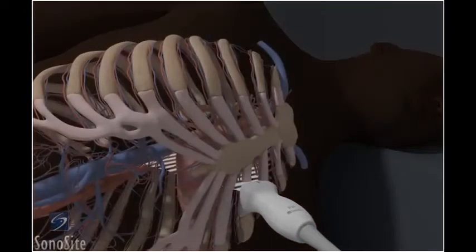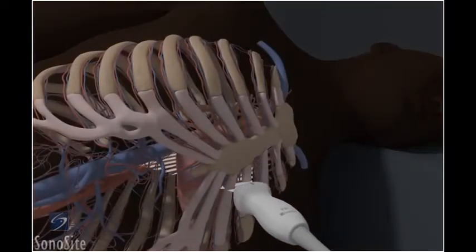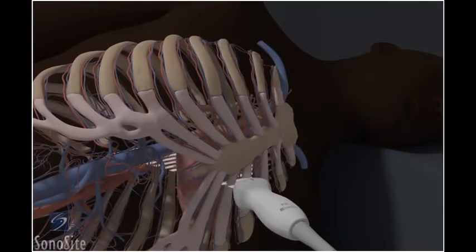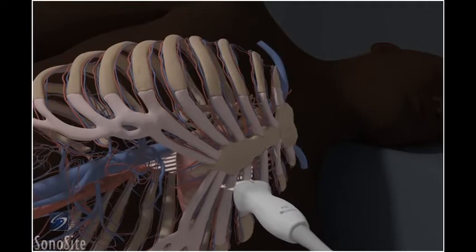Move between the third and fourth intercostal space and slide the transducer toward and away from the sternum to identify the optimal scanning window.